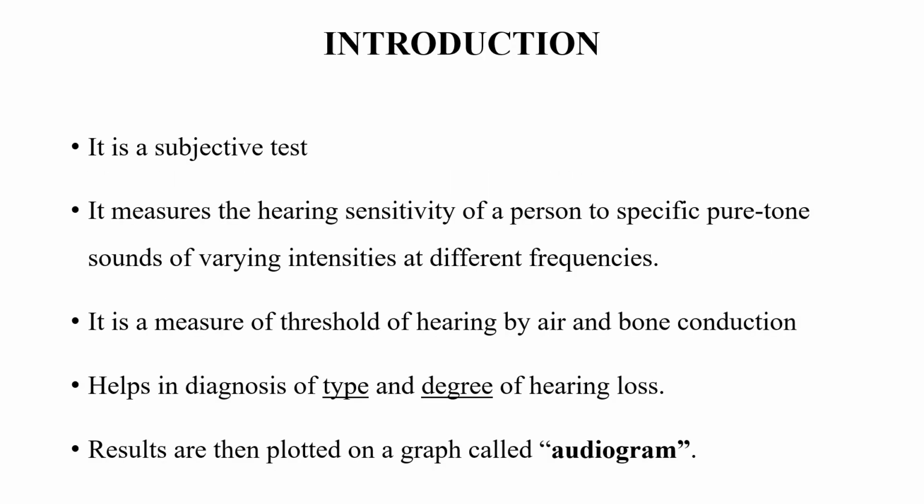In the introduction, the most important thing to note is that it is a subjective test, meaning that it is a test dependent on the patient. Whenever the patient responds to that particular sound, that result will be plotted in the form of a graph. So this is a patient dependent test. It is a subjective test.